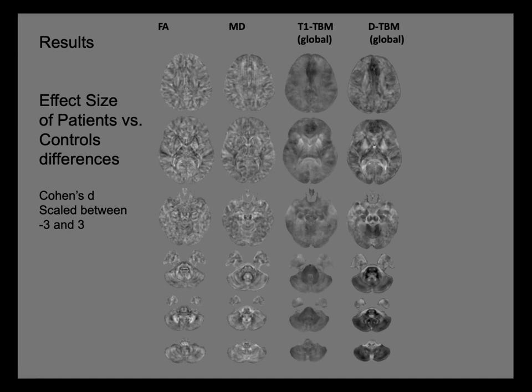This is good, since morphological differences should be there in the T1-weighted images and in the diffusion-weighted images. In fact, in this gray matter region, both techniques reveal quite severe hypoplasia in the Down syndrome population. But if you go further down to the brainstem and other structures, you can start seeing quite striking differences between the two techniques.